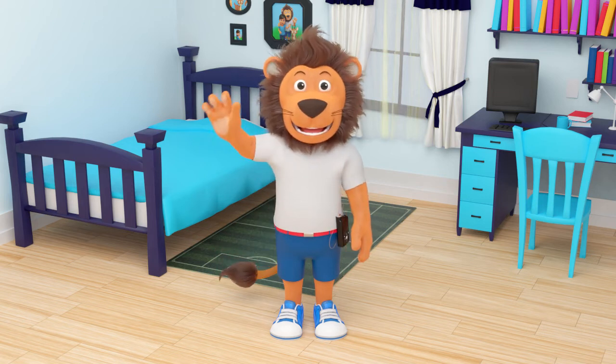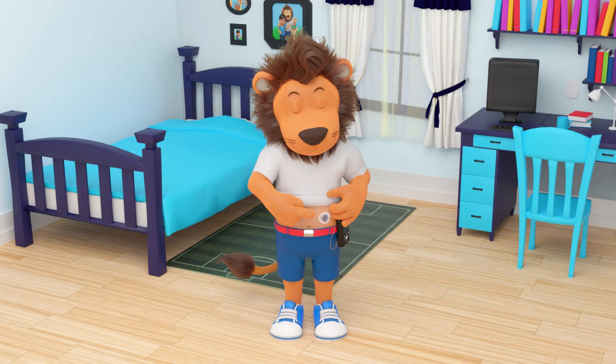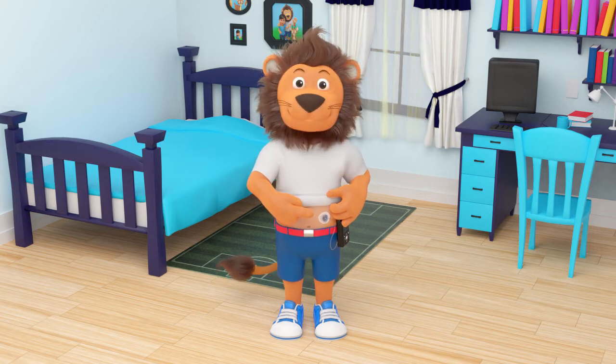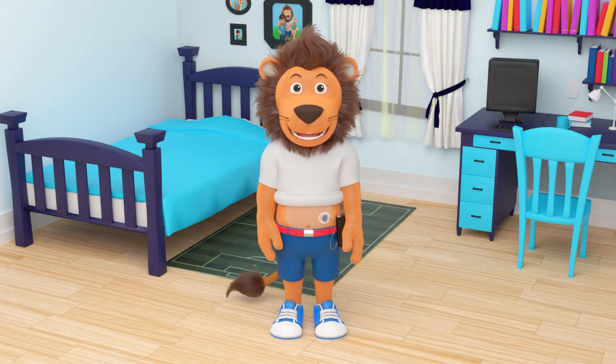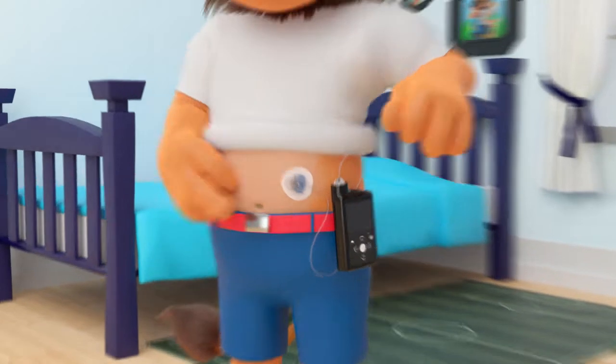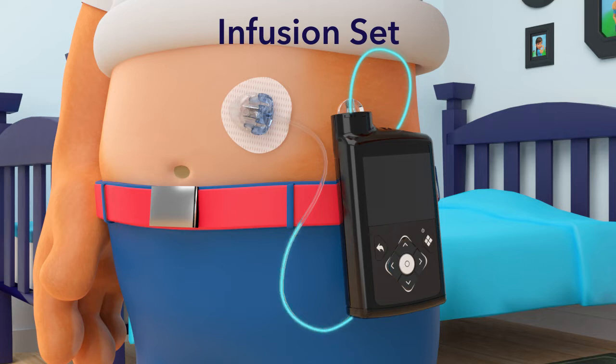Hi Lenny, what are you getting up to now? Oh, I see — today you need to change the infusion set of your pump. Children washing at home — your parents may do this with you now so you can start learning how to do it yourself one day. But what is the infusion set? What does it do? Oh, I see — the infusion set is the part of your pump that carries insulin from the pump to the body.